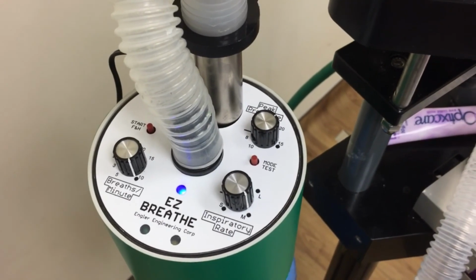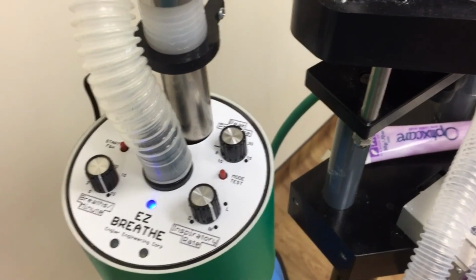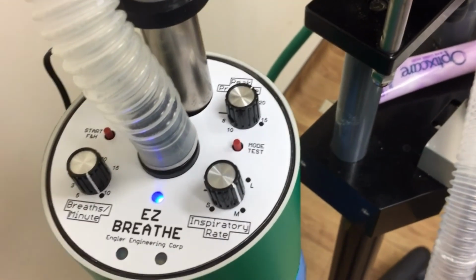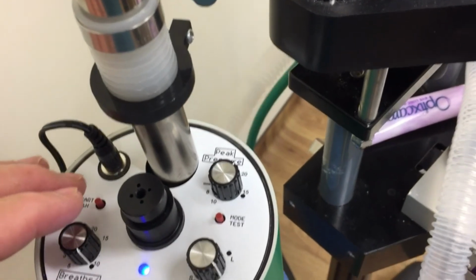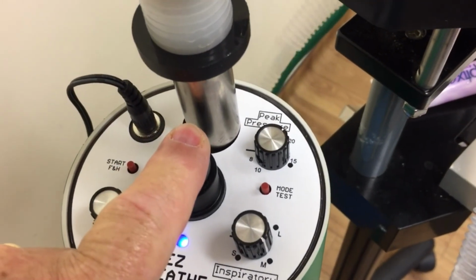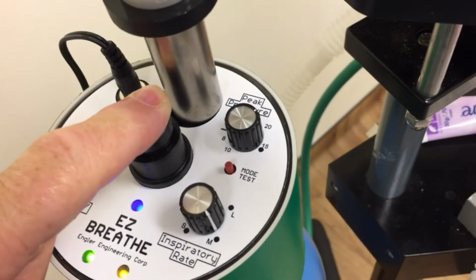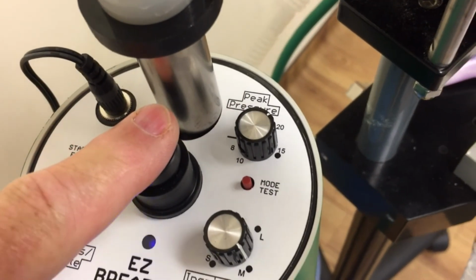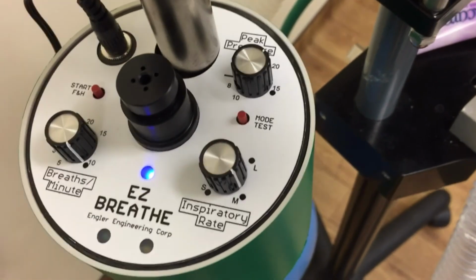The final alarm we are going to discuss is the overpressure alarm. This can occur for a number of reasons. Usually, however, it occurs because the scavenger has somehow been blocked. If we disconnect the scavenger, start the ventilator, and I block the scavenger, the pressure will rise, and eventually you will hear the alarm. When the pressure has come down again, the alarm ceases.